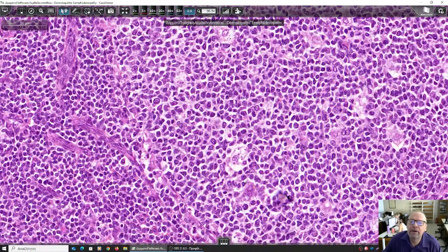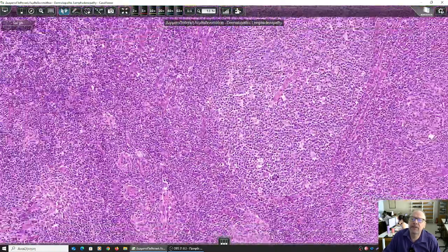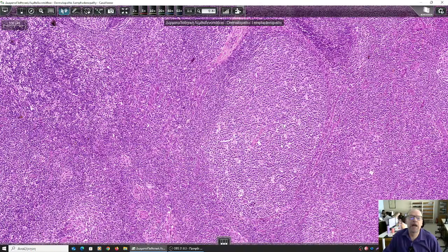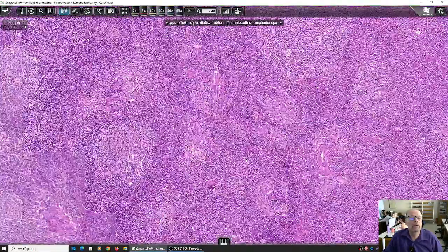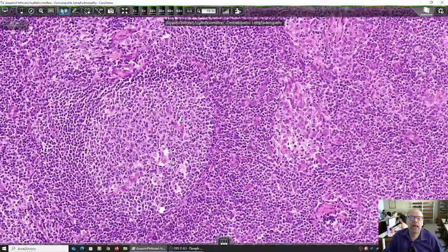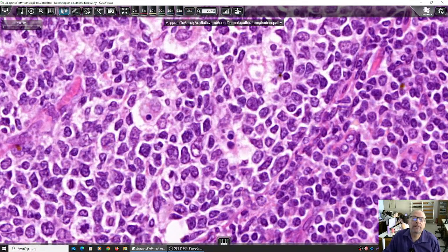And what other mechanism is functioning? Have a look at these cells. What has it phagocytosed? What are these small fragments here? Because if we have hyperplastic lymphoid follicles, that means that there is activation of the lymphoid tissue, and cells may proliferate more, but they can also do what? Have a look at this cell, this one. What has it phagocytosed? It is an apoptotic body.